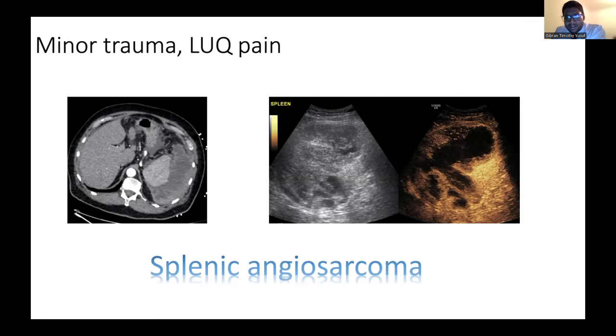And I was asked to take 15 core biopsies of this lesion in order to identify it. And I was told, you must take 15 because it's necrotic. So because I have more things to do with my day than that, I decided that I would only take 5, but I promised them I would take only the viable tissue, and they said it was impossible. So I performed contrast enhanced ultrasound and biopsied on contrast enhanced ultrasound, 3 cores, and they said it was the most tissue they've had from this type of patient, which is a splenic angiosarcoma.